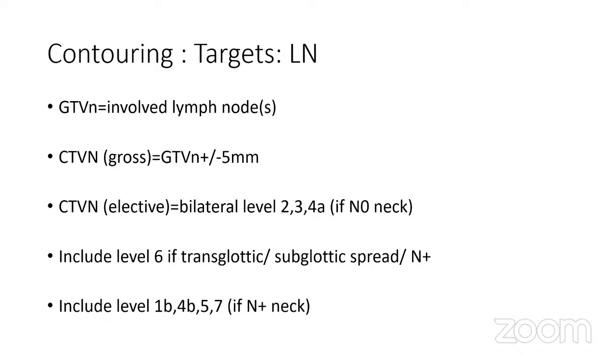Now, the lymph node volumes would be either 2 or 3 volumes, depending on whether you use 2 or 3 dose levels. So if there are gross lymph nodes involved, those would be treated to a radical dose. Regarding the elective nodes, there are some centers which would use an intermediate level of 60 and a lower level of 50 equivalent, and that's been the practice at TMH, and I think that's been the practice for most of us.